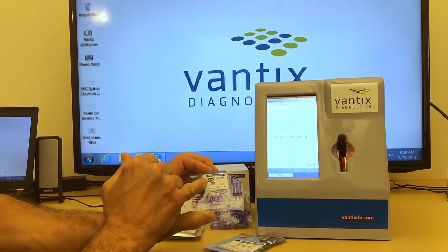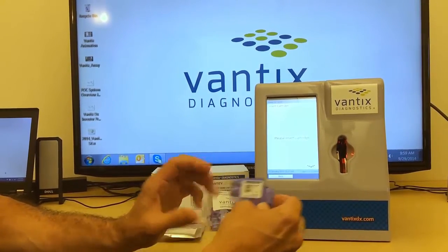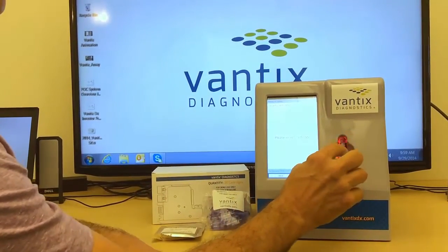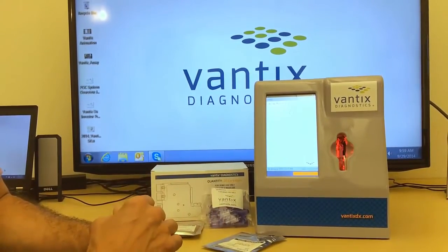The cartridge is also bar coded specific to the assay that we are going to run. The cartridge is then inserted into the reader, and the reader begins to run automatically.